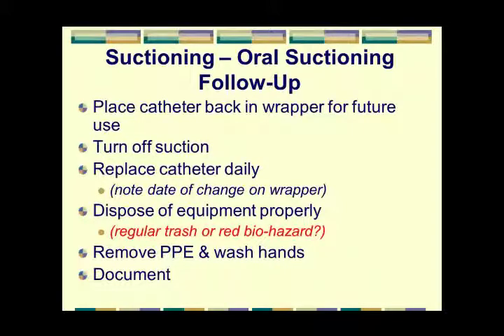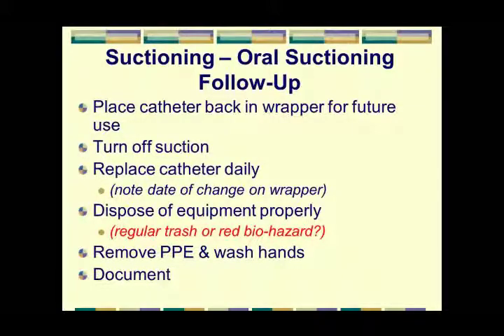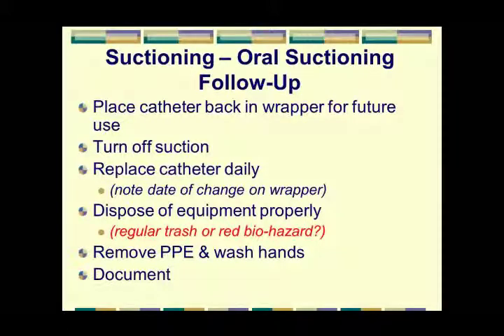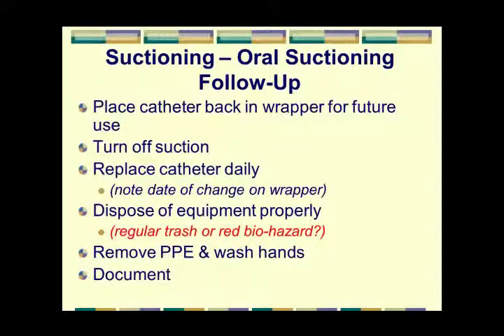What do we do nowadays? We keep the original paper packaging, reinsert the catheter in the paper packaging, and take it to the bed rail or take it to the vent, and change it daily. I can't tell you how many times I've walked into the patient's room and the suction catheter is lying on the floor. It's like, get a new one. Change them daily, or if they're on the floor.